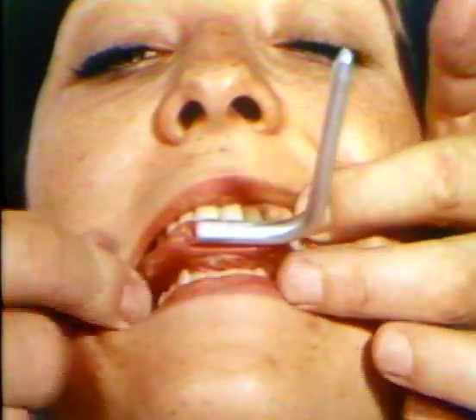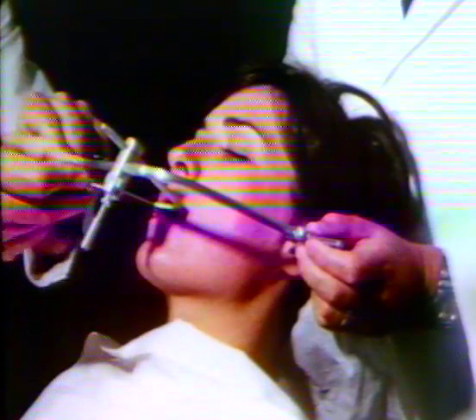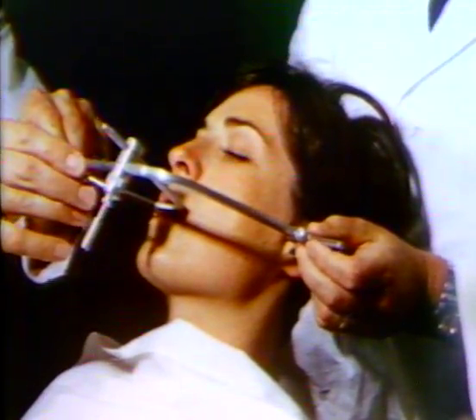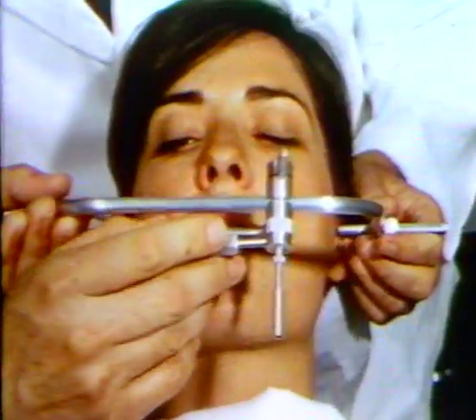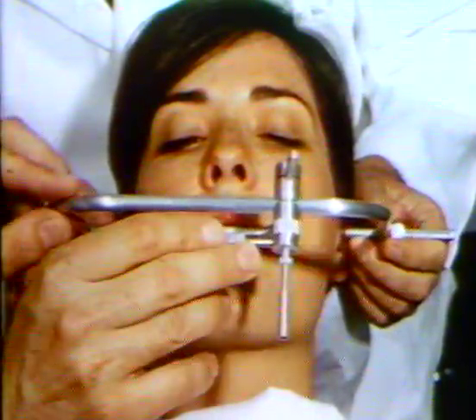The patient bites into the occlusal wax until the frame seats. The face bow is set over the markings and the front set screw tightened. If there is a change in position of the condyles during the tightening procedure, the screw mechanism should be loosened and the face bow adjusted.